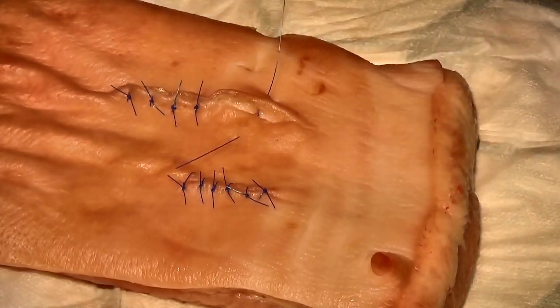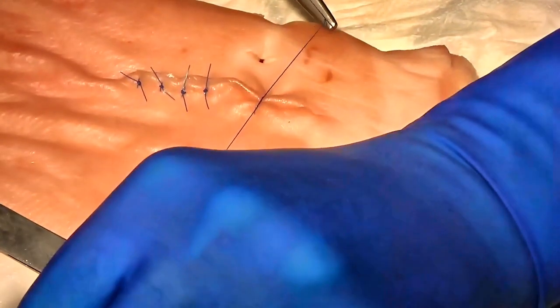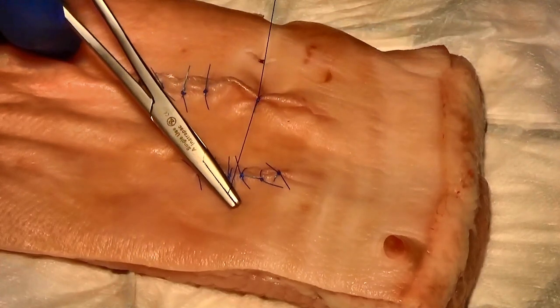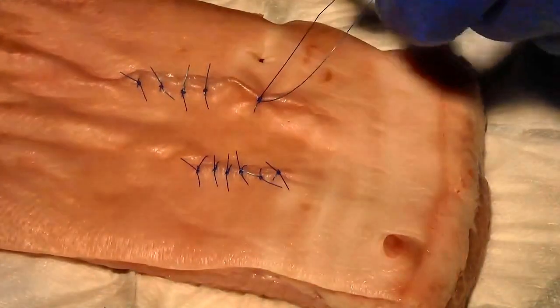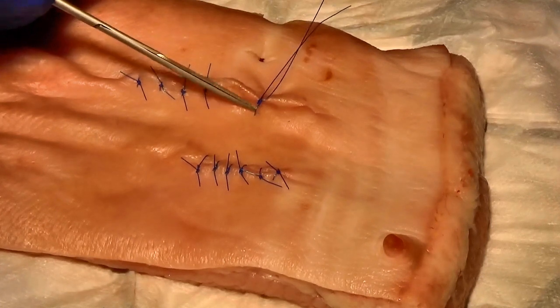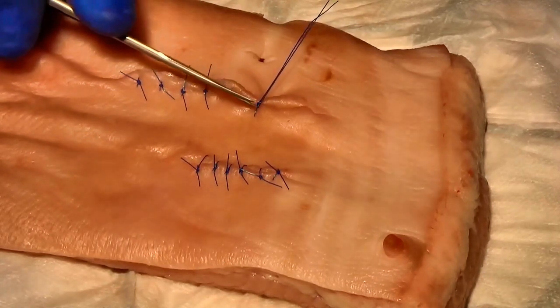So if you have too much tension, you end up with scarring, and you don't want to pull the tissue together like this. You can see how it's puckering the skin, and this will be painful for the patient and leave an ugly scar. The only thing we can do here is to remove that suture and start again.